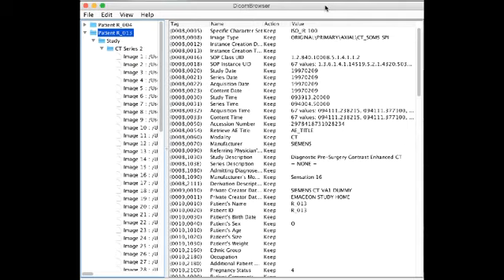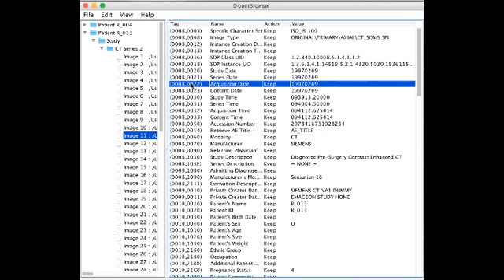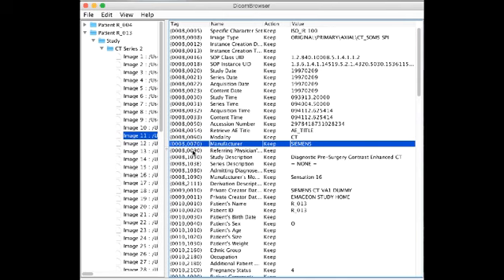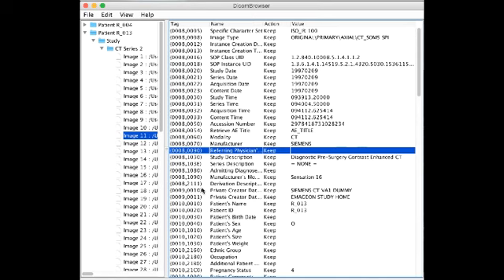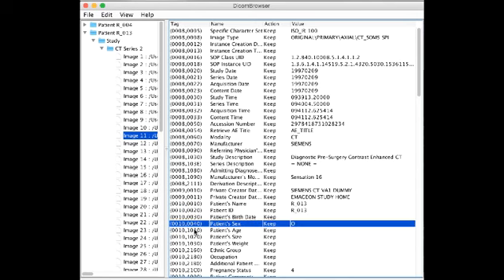So here I've downloaded some images from TCIA into DICOM browser to look at them, and I think we can just have a look and you'll understand DICOM a little better. So these are CT studies from a lung cancer patient. And here's the DICOM header. You can see these tags. See the tag? It's a word that describes metadata for that scan. So here you see the modality. It's CT in this case. You can also see when the scan was acquired, what scanner it was on, and a lot of other data here as well. And you can see even more when it's not anonymized, obviously. You'd have the patient's name, ID, birth date, demographic information.